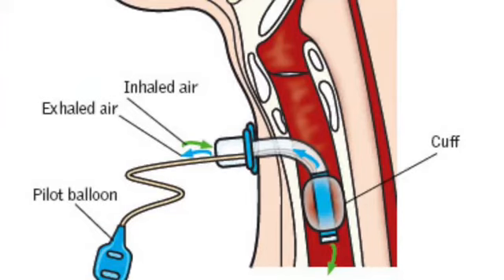When you pass the tube into the patient, the tube will be located in the trachea. There is a space or gap between the tube and the wall of the trachea. So this cuff, when it's inflated, helps to form a seal over that space.